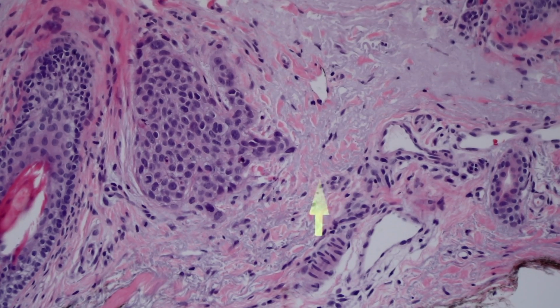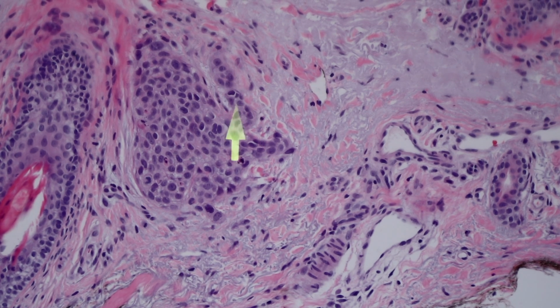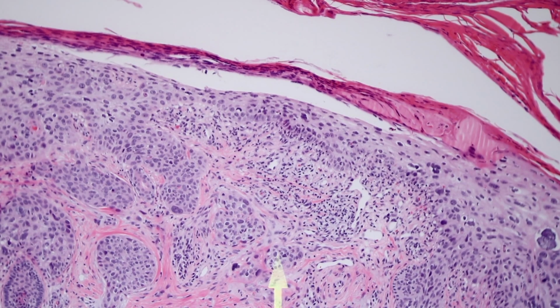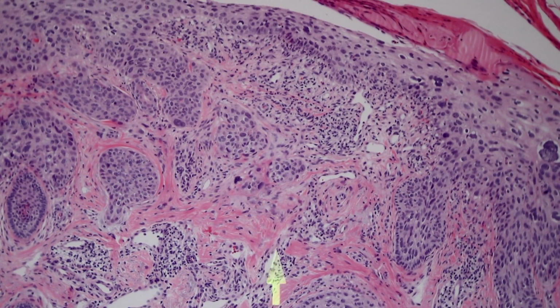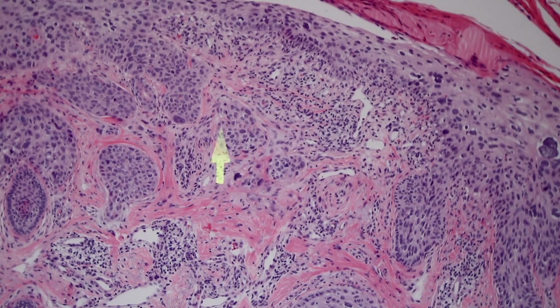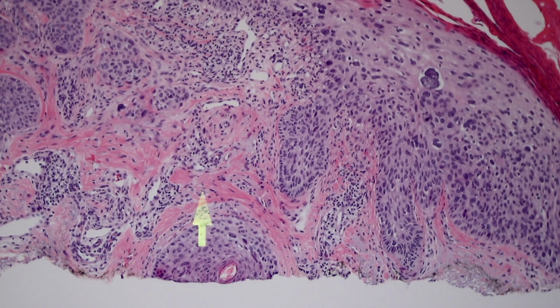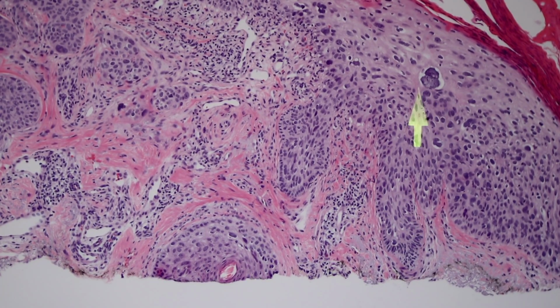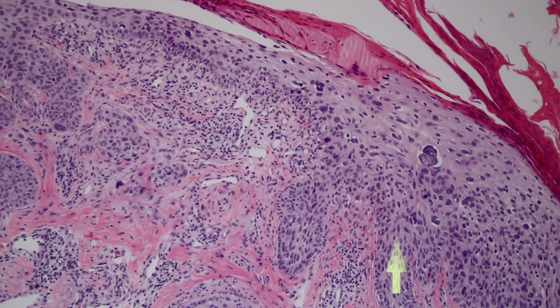Now in contrast, I think this is actually a nest of invasion. Look at how irregular it is. It's got little tiny islands that are pushing out and pushing right into the dermal collagen and in between the elastosis. So these are islands of invasion underneath squamous cell carcinoma in situ. So probably those are really invasive. But again, it can be a little hard to tell because you do have a lot of extension down adnexa, like this hair follicle, and then these long reedy areas. And then look at the wild atypia there. Sometimes the atypia is just massive in squamous cell carcinomas.